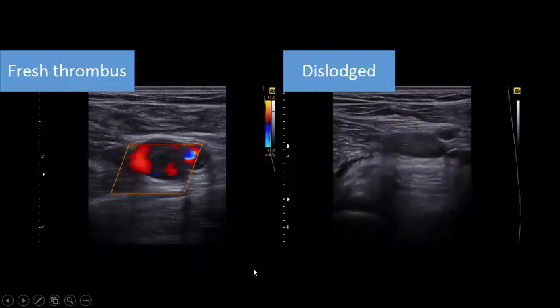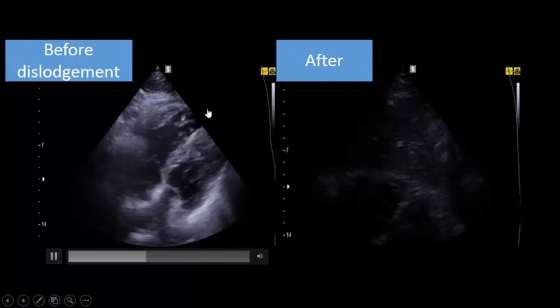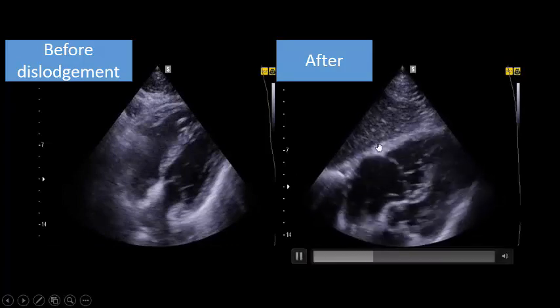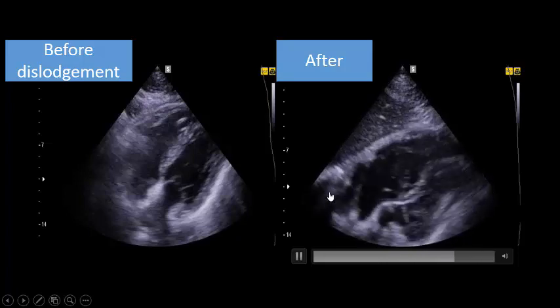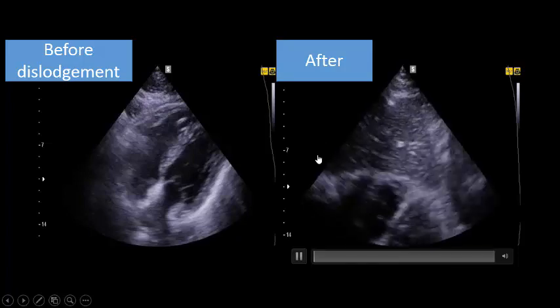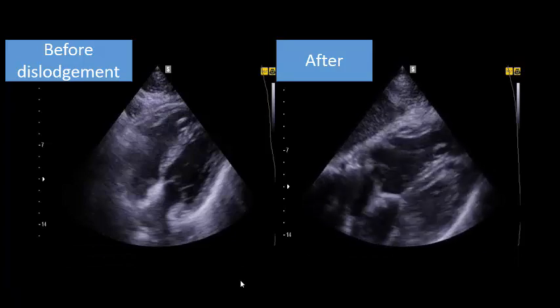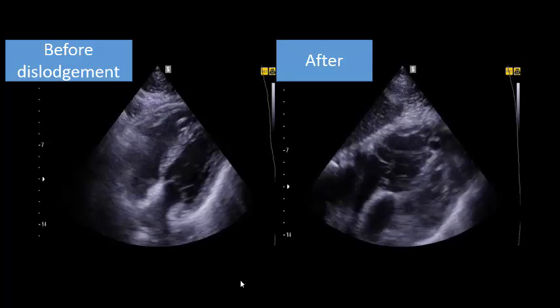And as you see here, this is the first echo study. Mild enlargement of the right ventricle with a thick wall, denoting a shower of pulmonary emboli. And this is after collapse, acute cor pulmonale. As you see here, marked dilatation with compression of the left side. And we intervened in no time because we already knew there was a mobile thrombus here. And if your patient collapses, just put the phased array probe on the chest for echo and look for signs of acute cor pulmonale.